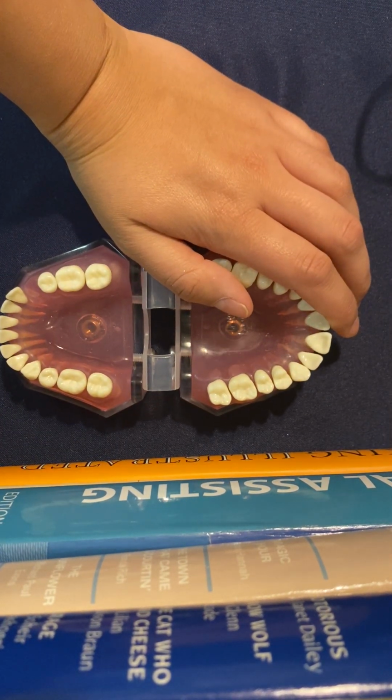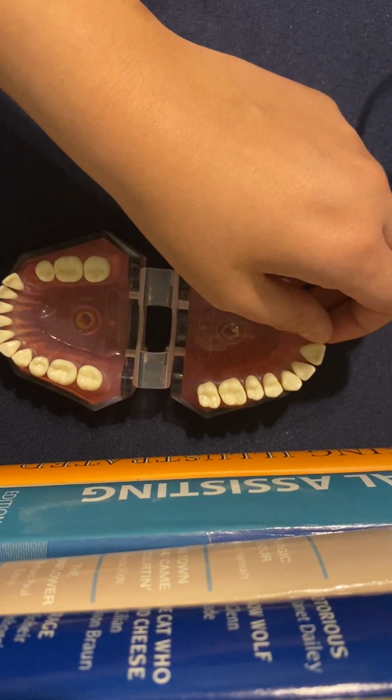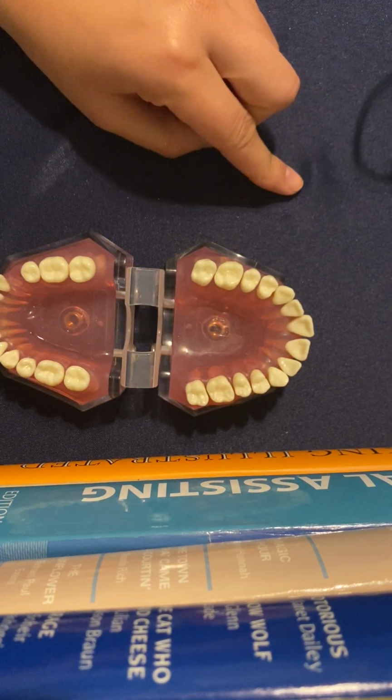All right, number 8. I did that. I just did 8. I did the molar. Sorry.